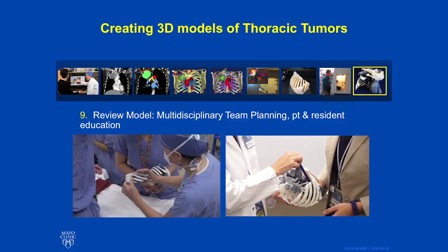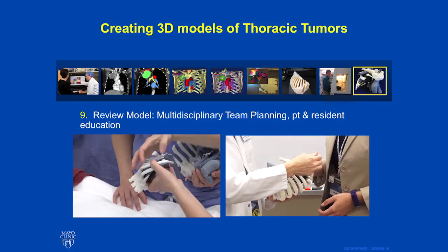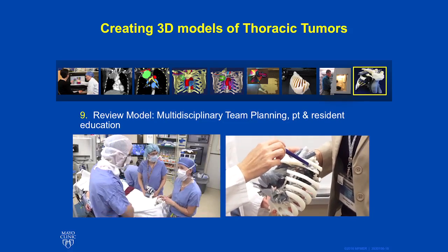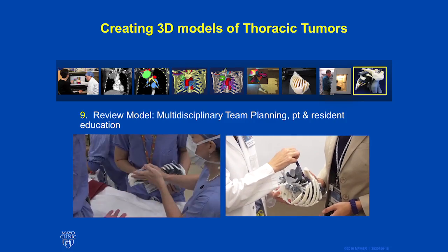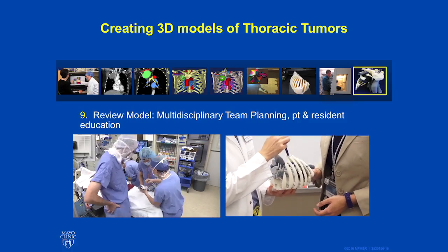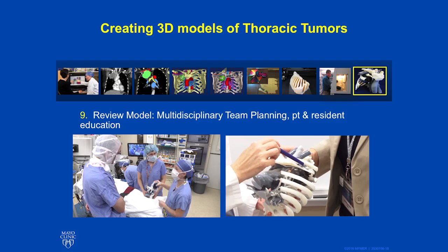that is happening. We have also found that the 3D printed models enhance our ability to gain informed consent and show patients what we plan to do and how they may look after. One of the greatest opportunities I've had is to teach Pancoast anatomy to different patients and residents.